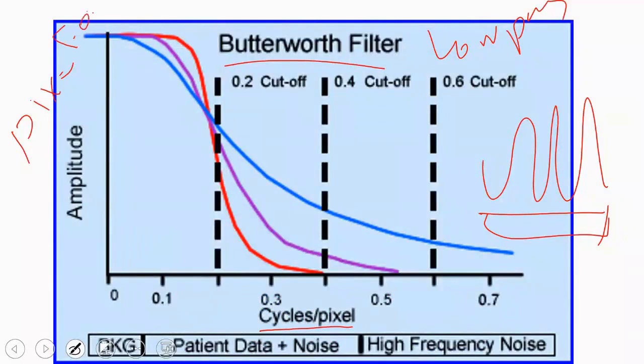It is about the field of view, which is the area you can see or the area you are capturing. What are its dimensions? It relates to the matrix size, which indicates how many rows and columns, how many squares are present within the field of view. For example, when you take a picture with your mobile camera and step back a bit, you expand the field of view that you can see, enlarging the area that the camera can capture. So, you have increased your field of view. But the image that will come out will have the same matrix, the same dimensions, the same squares. So each square's size will increase to cover your entire field of view.